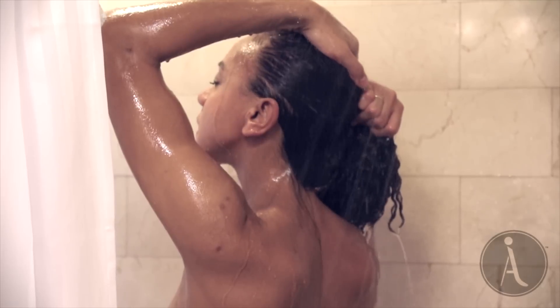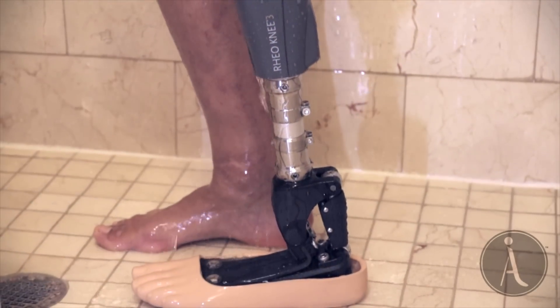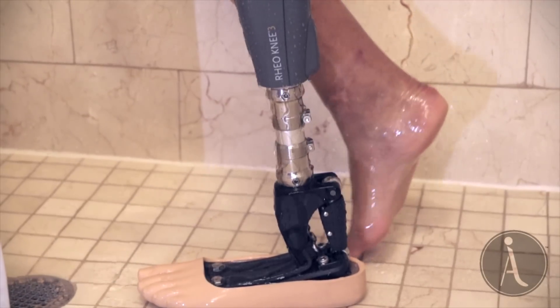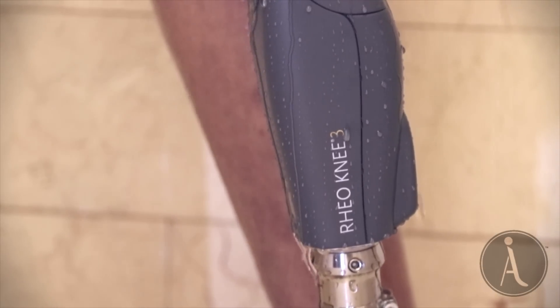A Step Ahead Prosthetics is pleased to announce the brand-new Rheo Knee 3 Enhanced and ProFlex waterproof foot. With an IPX4 weatherproof rating, this versatile system is your solution for everyday needs, no matter what the situation.